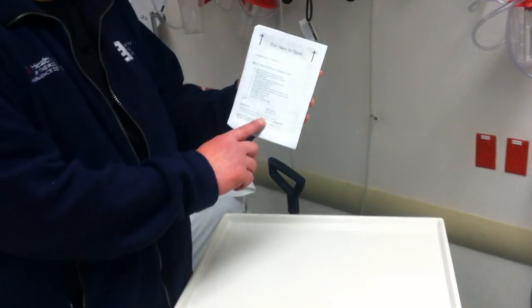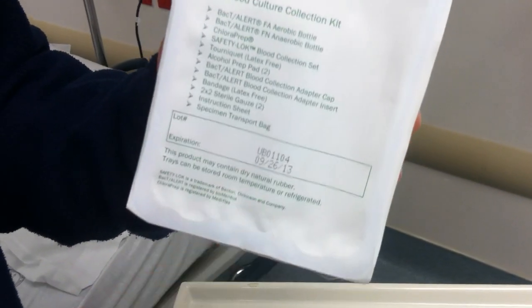First, as always, we want to make sure the kit is not expired. The date is here — this kit expires on 9-26-2013.